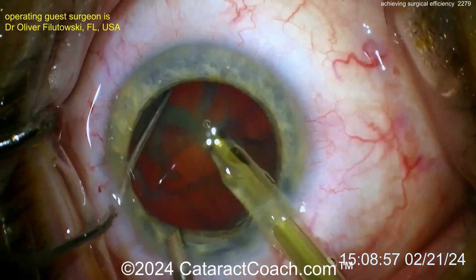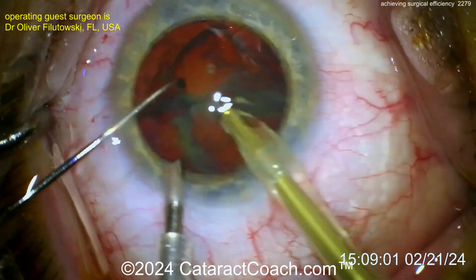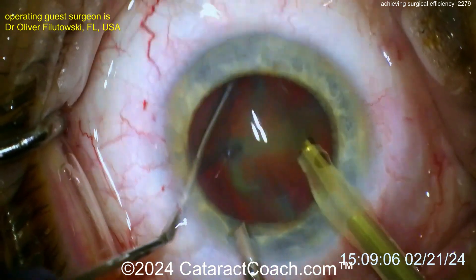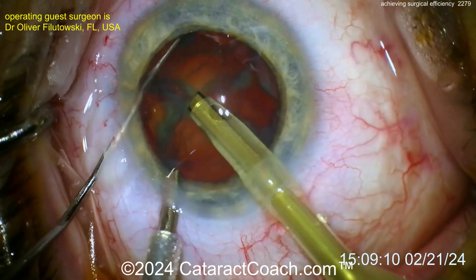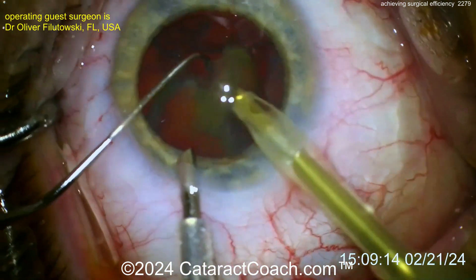Here's another chop — now you've got some quadrants. Just remove the pieces. Another chop — now you've got four quadrants. Probably just wolf them down at this point. Go in there, aspirate the pieces, bring them up. Using the chopper to help bring those things up — that's a useful technique here.